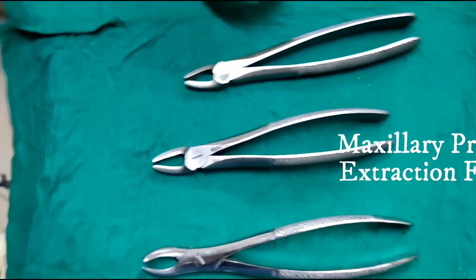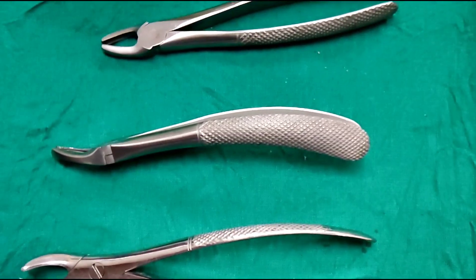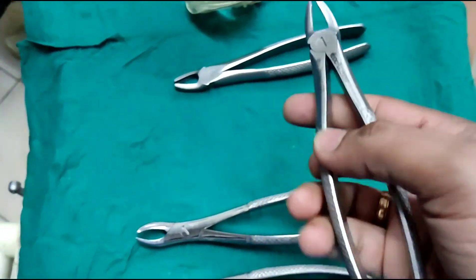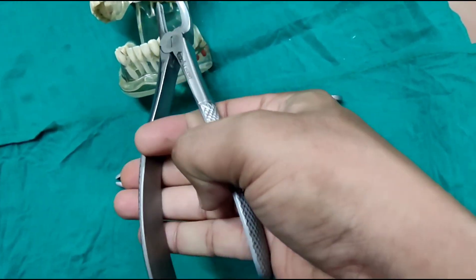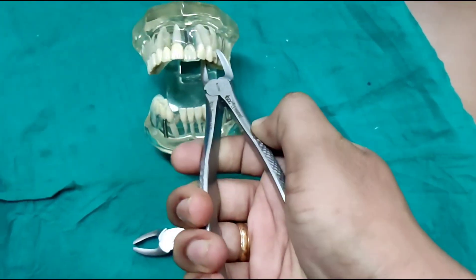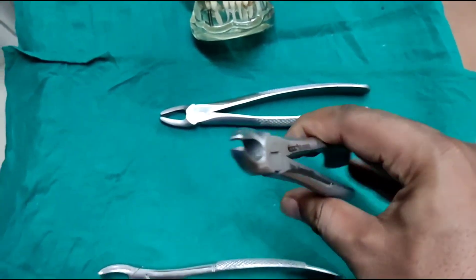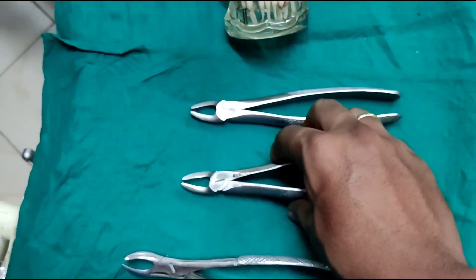Now coming to the premolar forceps — this can also be used in extraction of the canine. We can see that there is a slight curvature in the handle. This is to help us grip the forceps properly, because in the posterior teeth, for easy accessibility, we can hold the forceps in such a way and then engage the teeth and give the required motions. The beak of the premolar forceps is similar to the mandibular forceps — there is a little spacing in between the tip of the beak, and the beaks are wider in comparison to the anterior forceps.